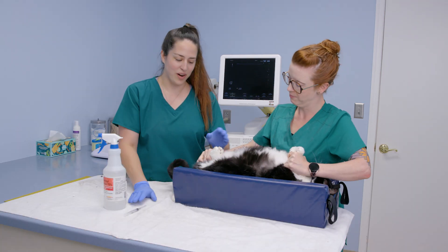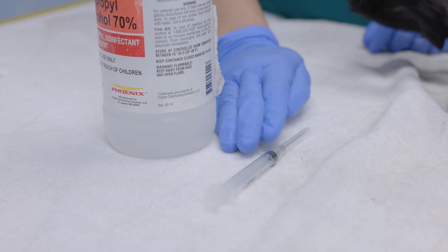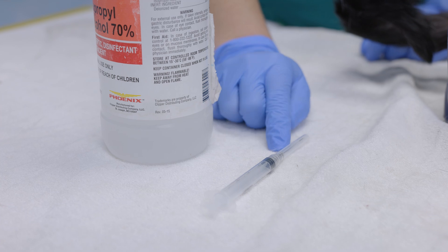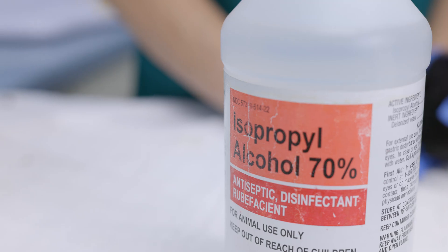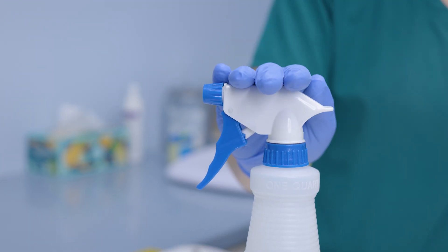We'll have our supplies prepared here. We have our 3cc syringe with our one and a half inch, 22-gauge needle, and we have our alcohol here to wet down the area on the abdomen to be able to visualize with the probe.